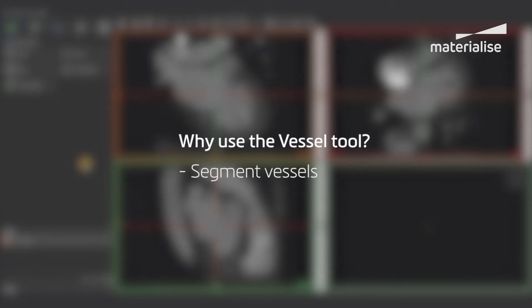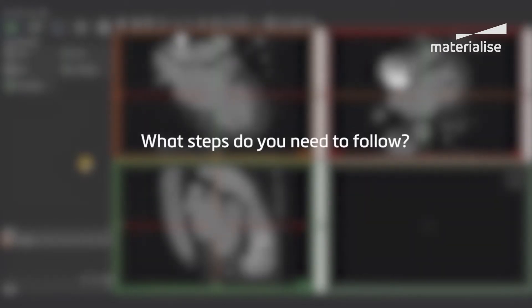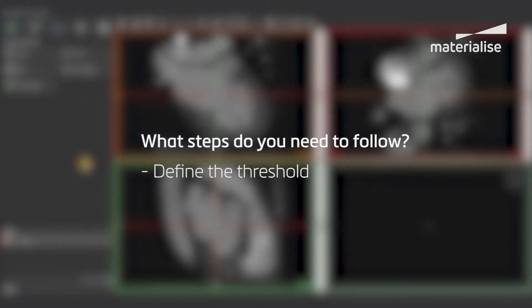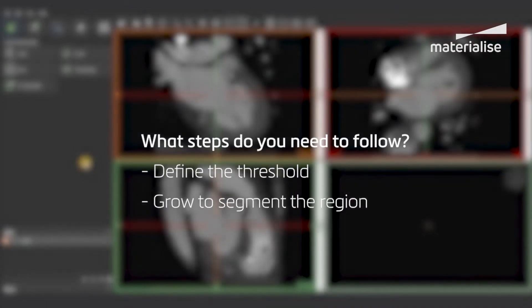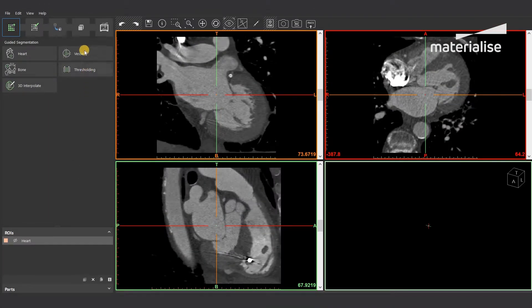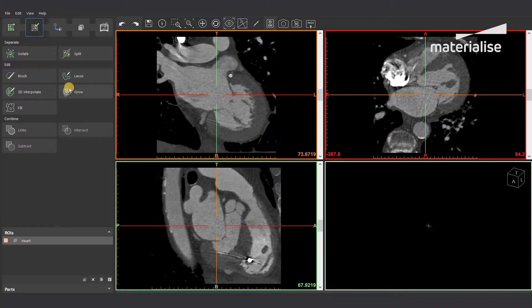You can use the Vessel tool to segment a region of interest by growing it with a certain threshold. The Vessel tool is located in the first step of the workflow, the Create Region of Interest step. In the Edit Region of Interest step, there is a similar tool called the Grow tool, which can be used for editing an existing region of interest.